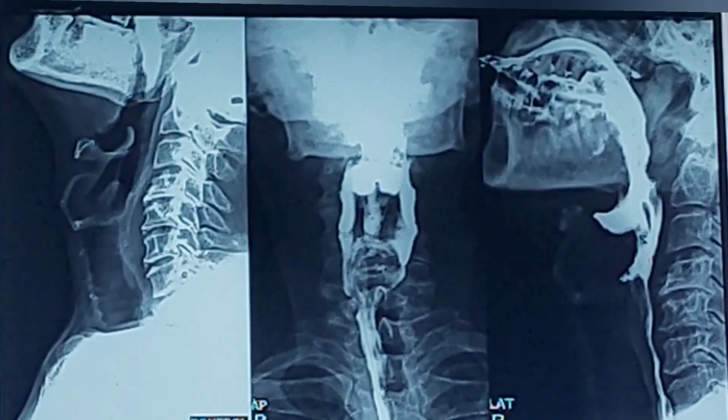Then what is barium swallow examination? In this test the person is asked to drink some barium sulfate solution, about 100 ml, and then radiographs are taken during swallowing of this solution. This suspension is given to visualize the lumen of the GIT and its mucosal defects, particularly in the esophagus.